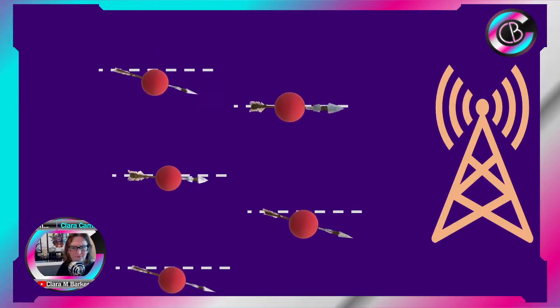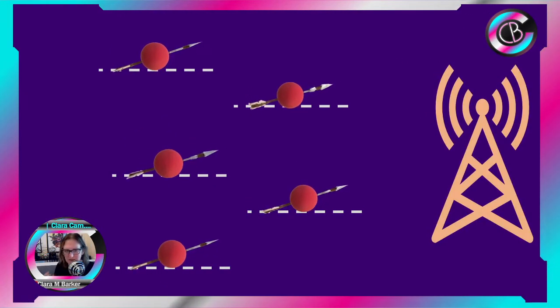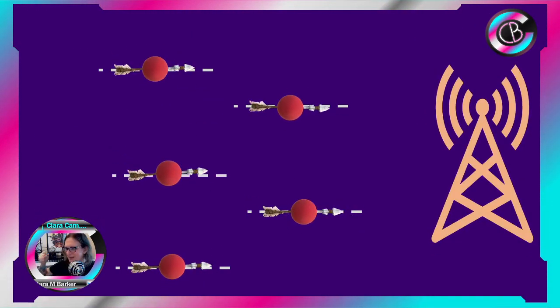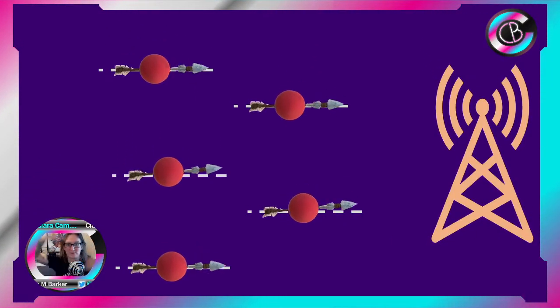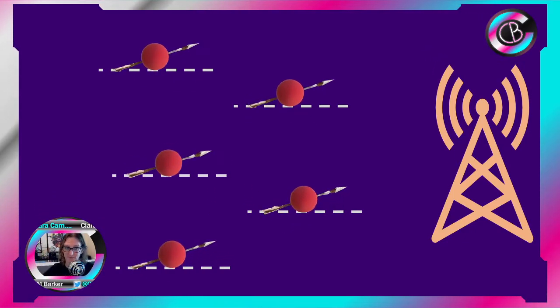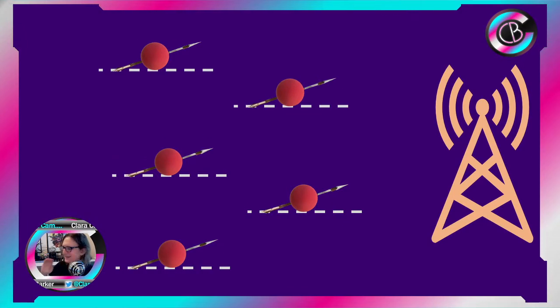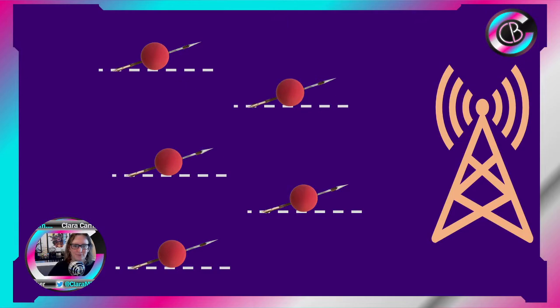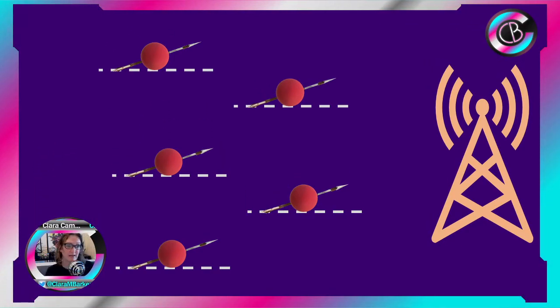You know, resonant frequencies, we're working at the resonant frequency. If you've ever seen those videos of a bridge where people are walking at a particular frequency, so it starts to vibrate, the bridge actually starts to wobble. If you've not seen those videos, definitely look at resonance of bridges on YouTube because it's quite amazing to see. But if you apply a particular frequency, then things will start to move in phase. And that's what we have here. Our hydrogen atoms are all spinning now in phase.